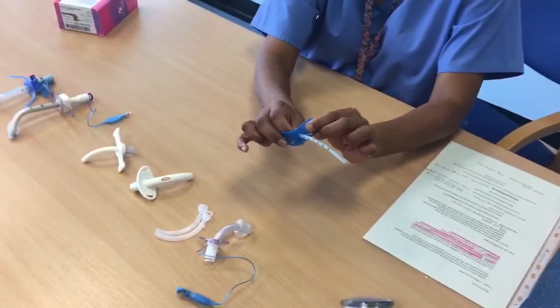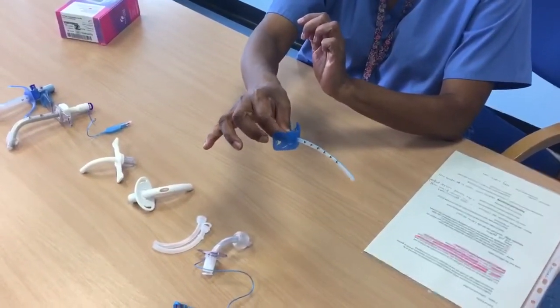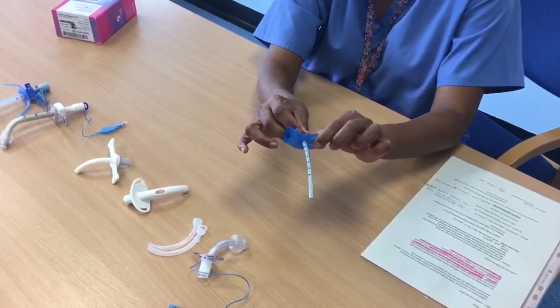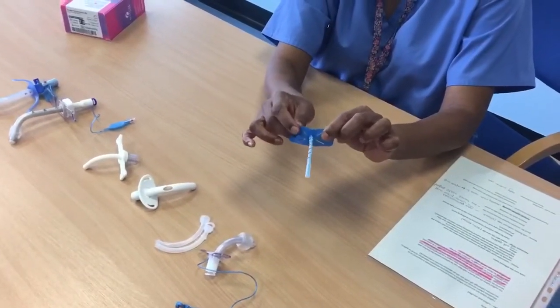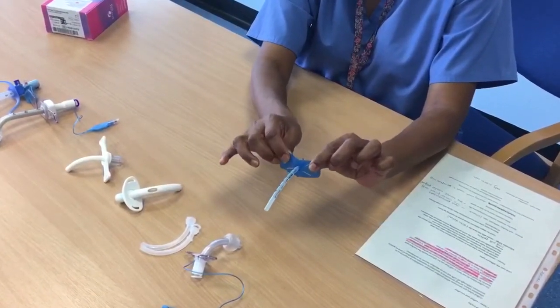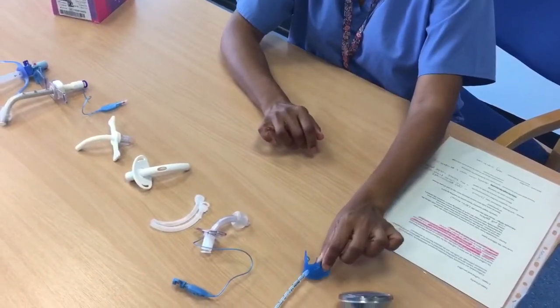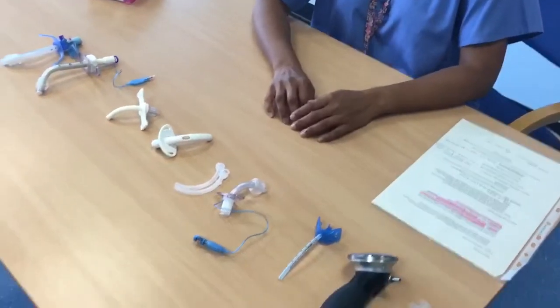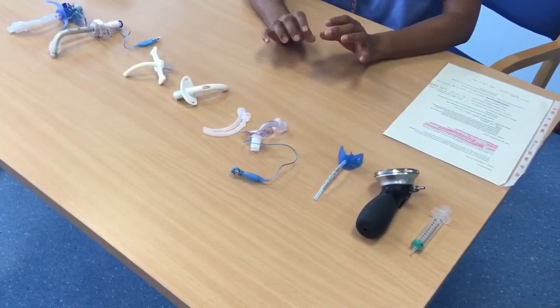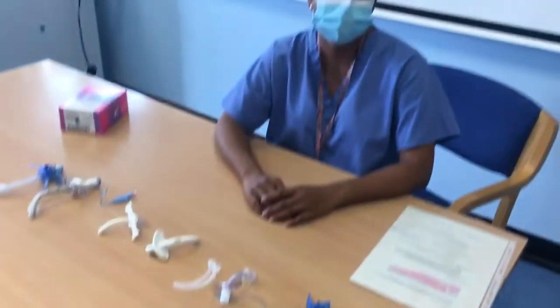Now, it's quite a small tracheostomy tube, used purely for secretion clearance. It's not used for ventilation, but purely secretions. So you'll see these in the ward more often than not. As I say, it's quite small, and probably a size 10 or 12 suction catheter would be used with that tracheostomy tube.